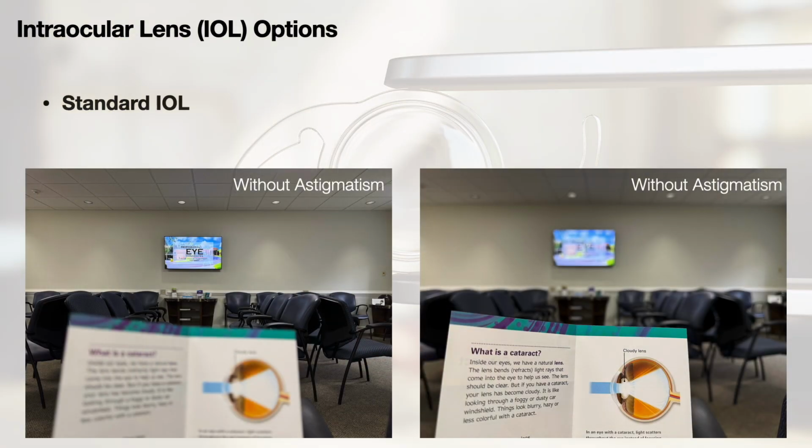Most people typically choose between seeing well at a distance, as you can see on the simulated vision example on the left side. Now on the left, you will notice that the TV image is clear to simulate good distance vision. However, on that side, it is difficult to read the print off of the brochure. So in this case where distance vision is selected, then reading glasses will be needed.